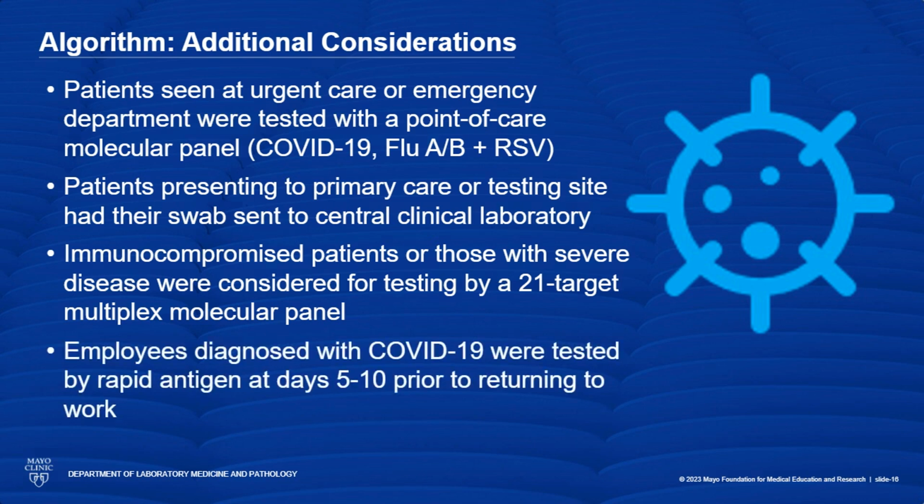And then finally, an interesting aspect of 2021 and 2022 was, again, the availability of antigen tests for COVID-19. And at Mayo Clinic, we performed a study where Mayo Clinic employees who were diagnosed with COVID-19 were then tested by a rapid antigen test at days 5 through 10 after their diagnosis and prior to returning to work.